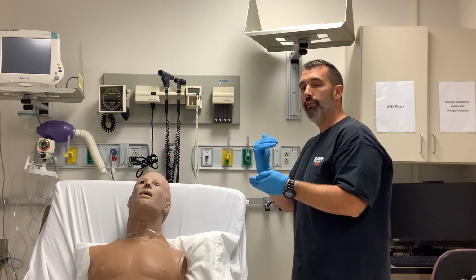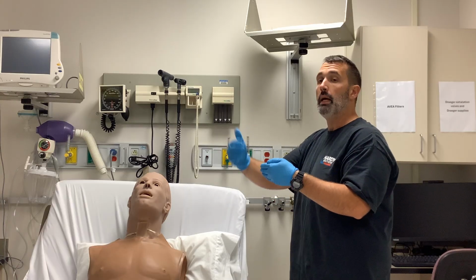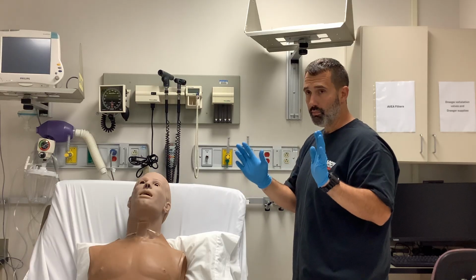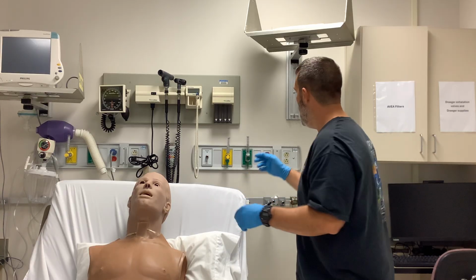And you can add 4% to that for every liter above 1 liter, so 2 liters would be 28%, 3 liters would be 32%, et cetera, until you get to 6 liters. And then at that point, if you're having to go up higher than that, you're probably choosing some type of alternate means of supplemental oxygenation.